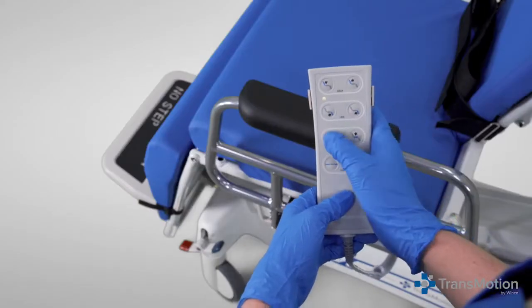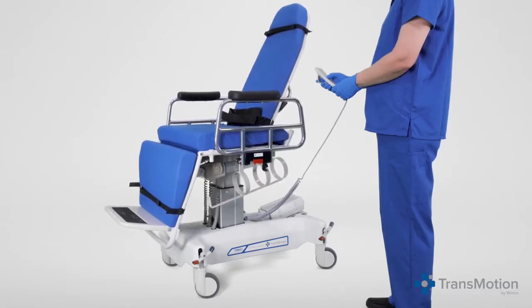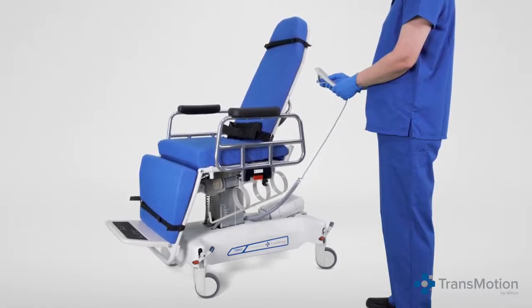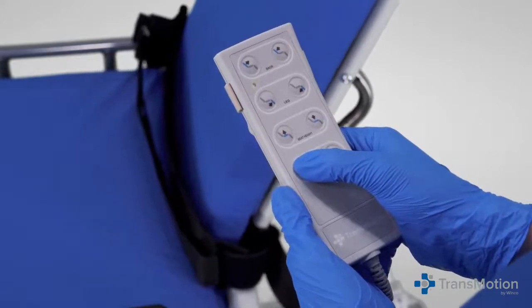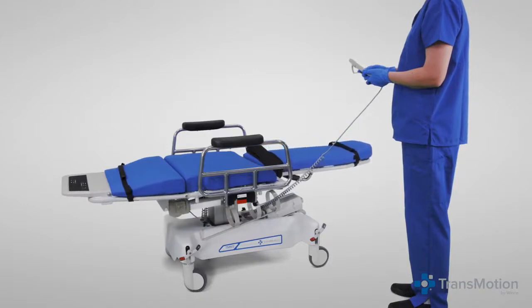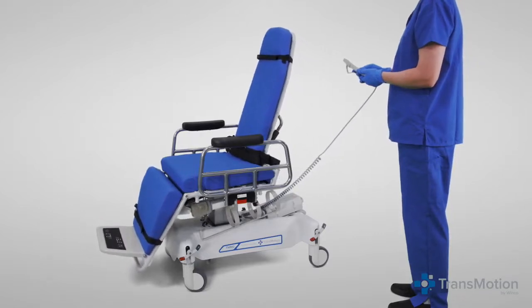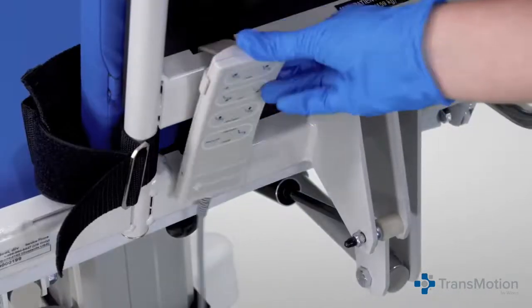The third row buttons on the pendant control the height of the chair — press the left button to raise the chair, or the right button to lower the chair as indicated by the arrows. The fourth row controls the simultaneous activation of the leg and back sections. Press the left button to raise the chair leg and lower the back, putting the chair in a flat position. Press the right button to lower the leg and raise the back section. The pendant has a universal clip that attaches to the arm rail or chair back for easy storage and access.